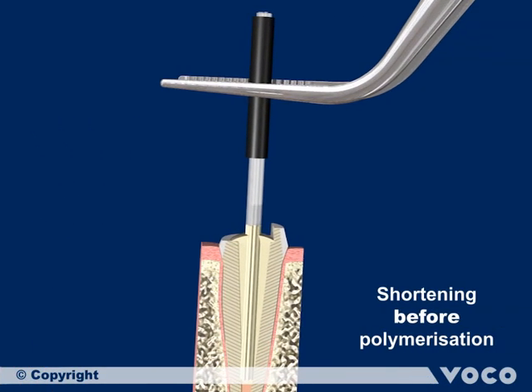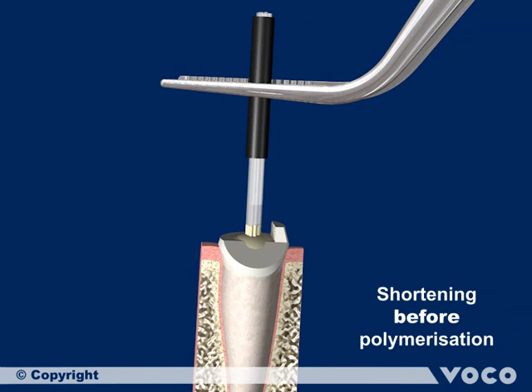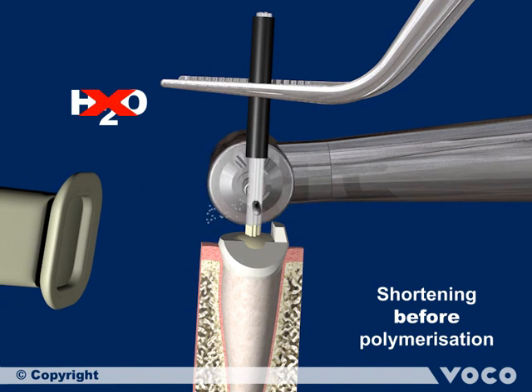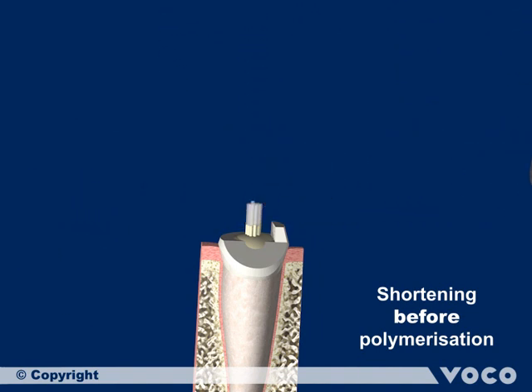This sequence shows the shortening and adjustment of the single glass fiber posts prior to the light polymerization of Rebuilder DC, the luting and core build-up dual curing composite. Fix the Rebuilder Post GT with tweezers inside the root canal and cut the single posts of the bundle with a diamond burr at high speed without water cooling and with suction. Then the single posts have to be spread.